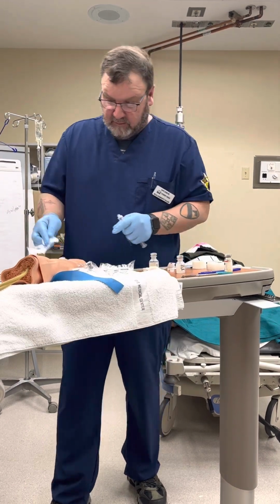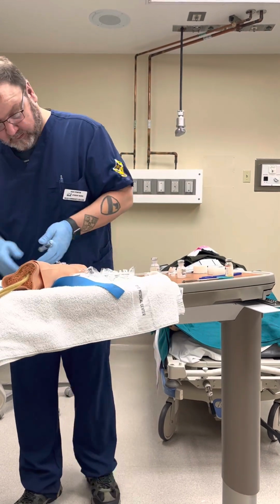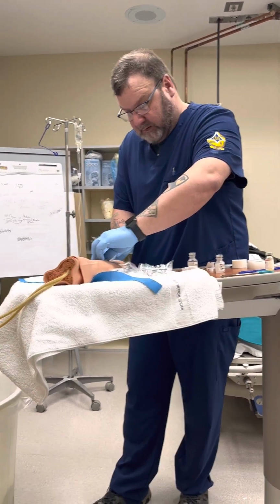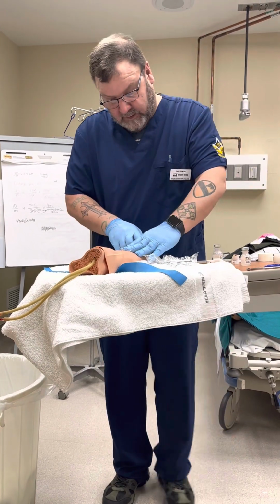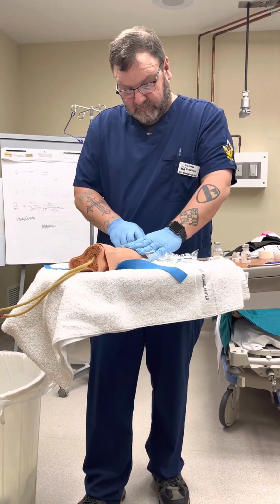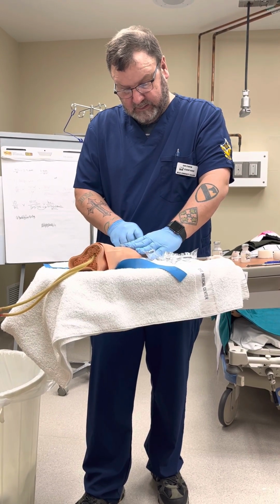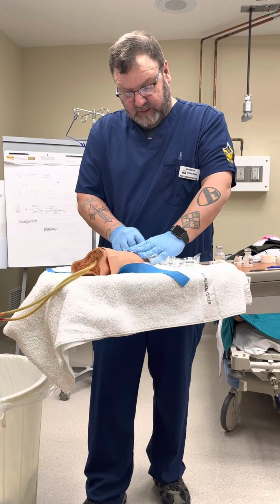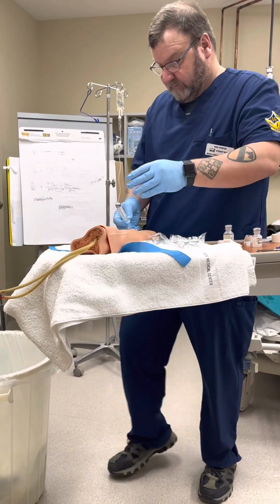I'll take my alcohol wipe, clean my port. I'm going to flush this with 5 milliliters of saline, making sure that it's patent. We don't have any redness, infiltration.